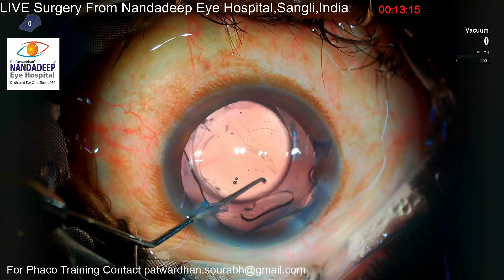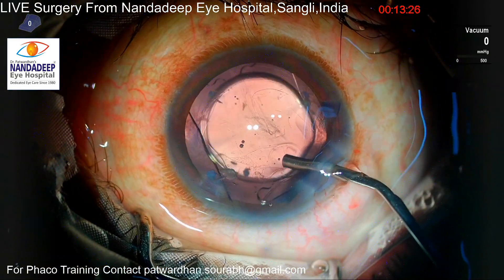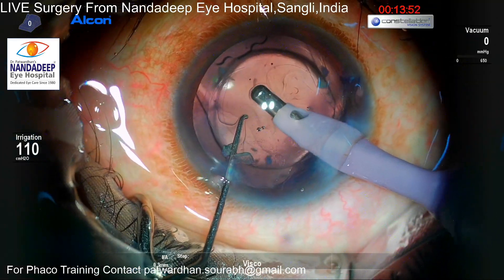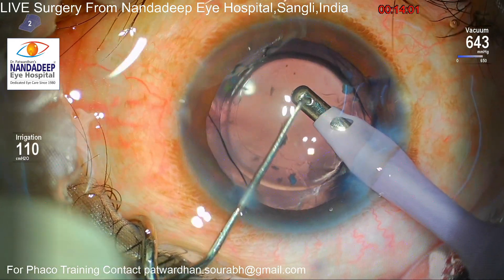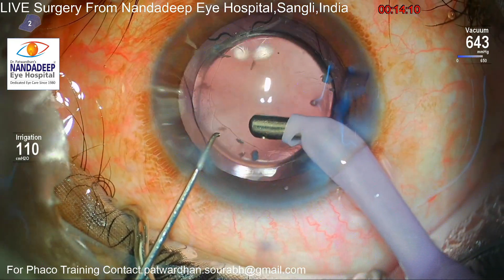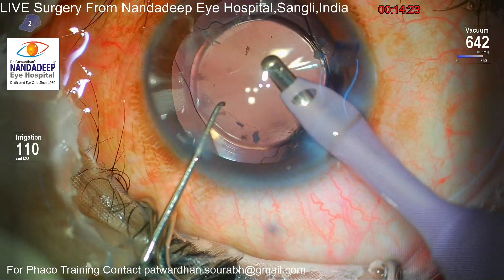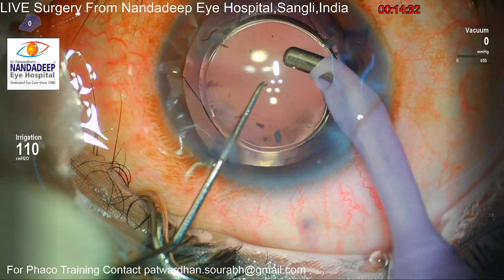Now I am implanting the extended depth of focus IOL. You have to be very careful to know the exact orientation of the IOL — this is a plate haptic IOL — so I want to be careful to push it into the bag. You can see I am using a viscoelastic cannula to deepen the anterior chamber and push the IOL into the bag. The last part is aspiration of the viscoelastic from the anterior chamber, and with this plate haptic IOL we have to be very careful to remove the viscoelastic from the bag as well.